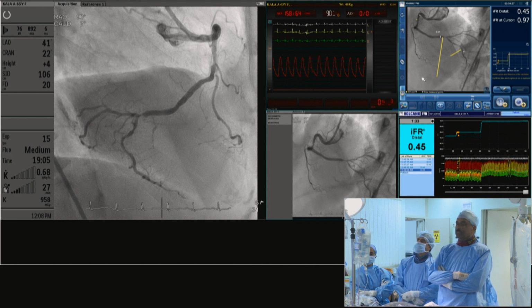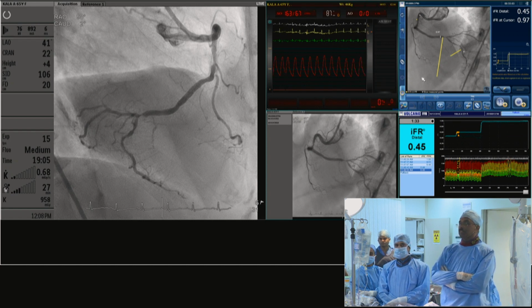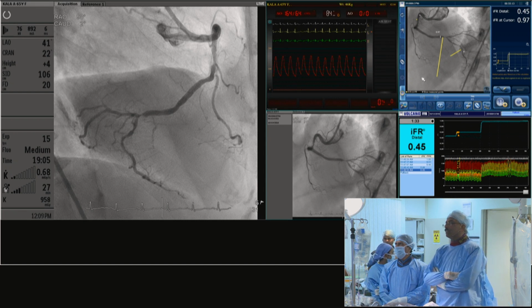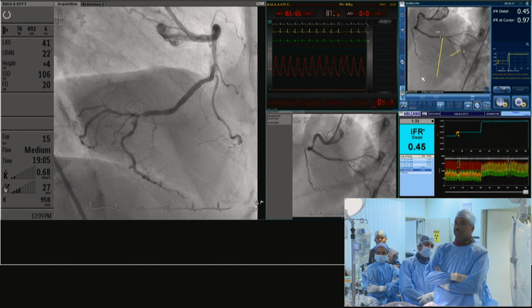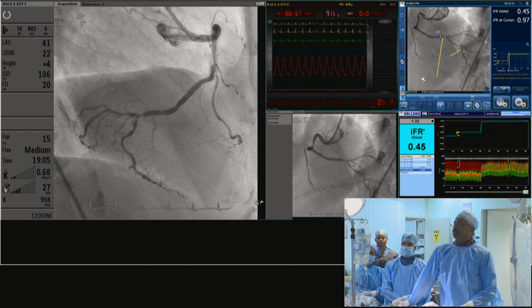I'm sure somebody in the audience may actually ask whether the mid lesion is significant or not. The distal lesion certainly looks significant, and if the patient had inferior MI, hopefully that is the culprit. Maybe if you were going to push the option for measuring physiology, then it would be only after treating the distal lesion to decide on the mid lesion. Otherwise, I don't think we would have any idea. I don't think anybody in the audience is raising hands for distal lesions.